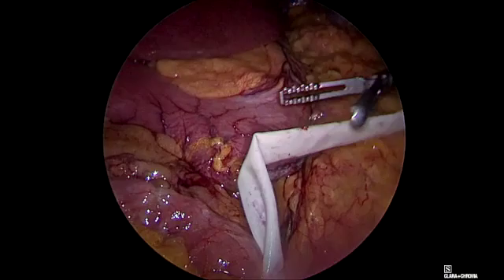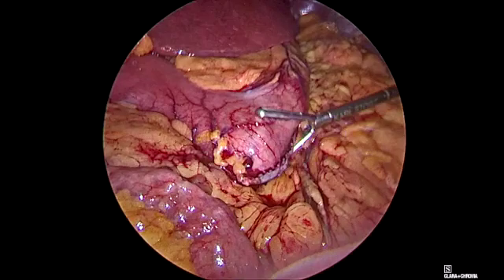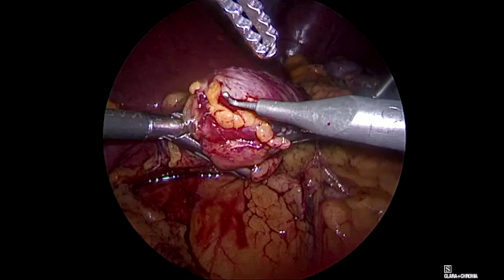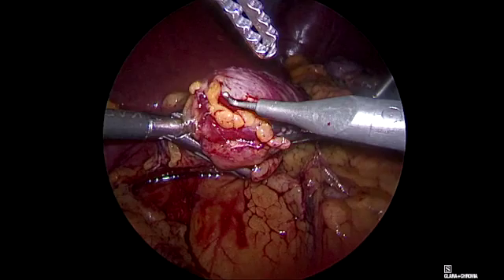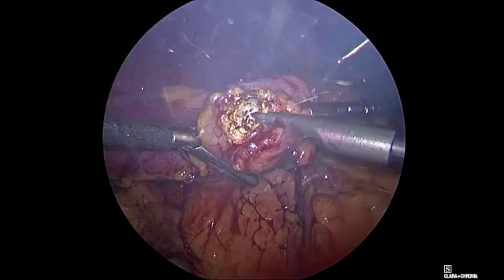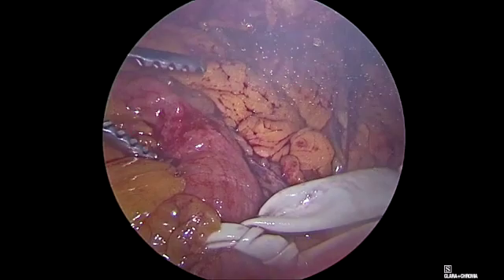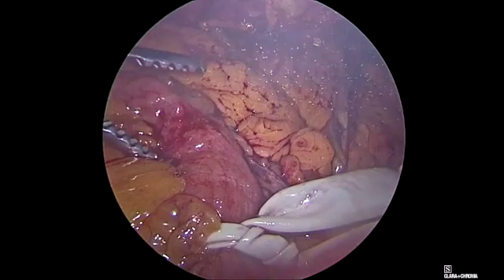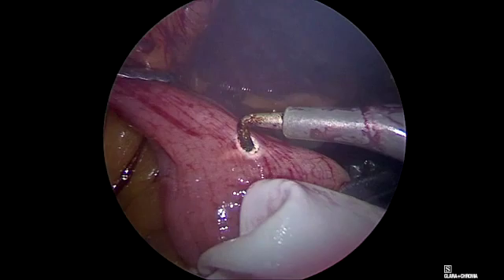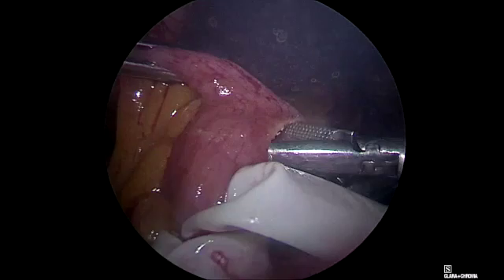We ask the anesthesiologist to push down the bougie tube. The bougie tube helps a lot with the opening of the stomach and we want to do it a little bit anteriorly. We are creating a hole — without the bougie tube it would be a tough task because the stomach is thick, but with the bougie tube inside it's very easy. Here we see the bougie tube. We want to make a hole large enough for one arm of the stapler.